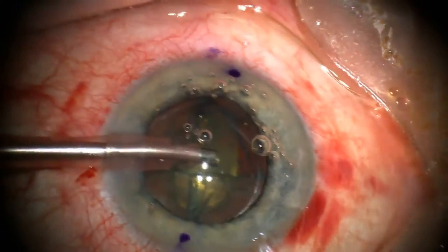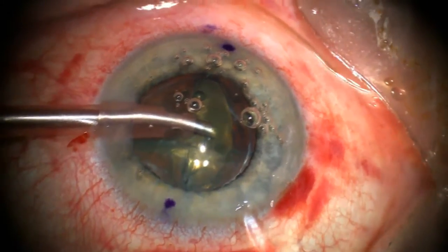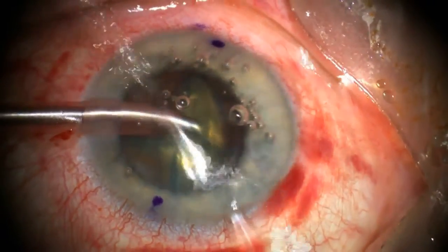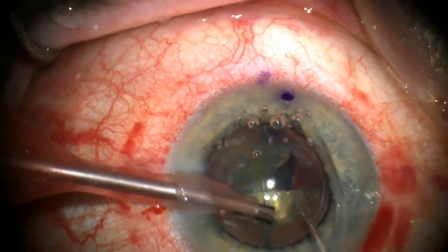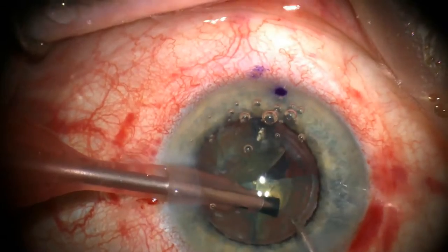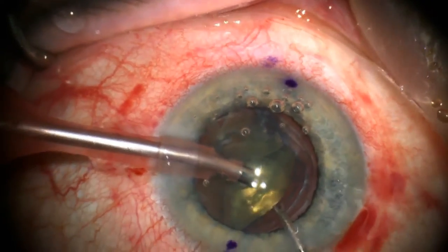After the quadrants are fully separated, the phacoemulsification cannula can be brought out and used to emulsify each part of the nucleus. This, of course, is a very efficient way to remove the cataract in preparation for placing the intraocular lens.